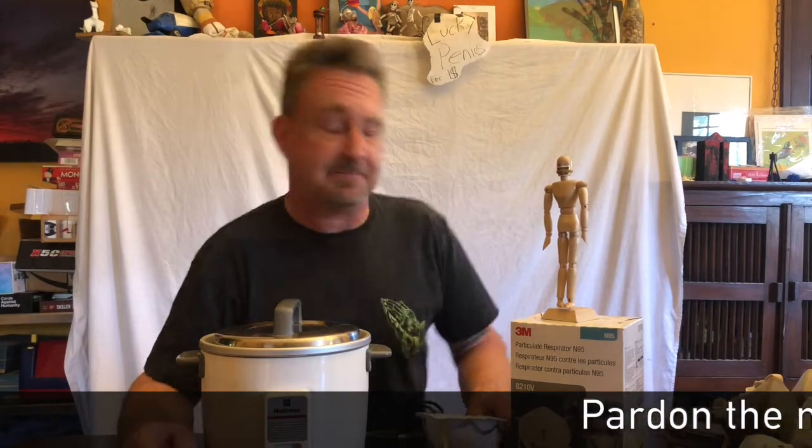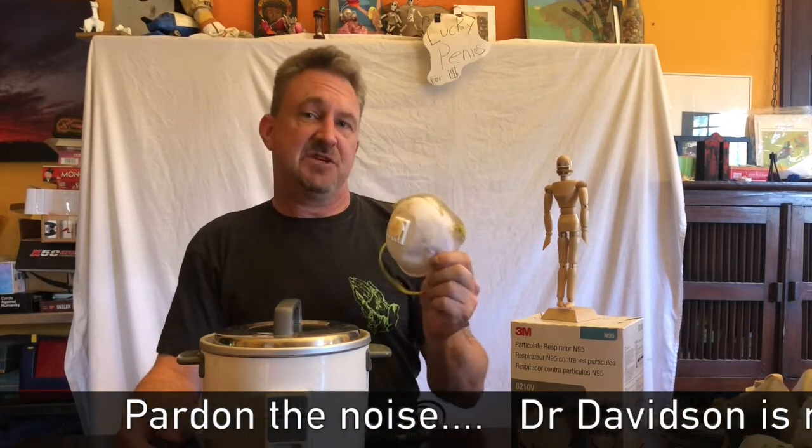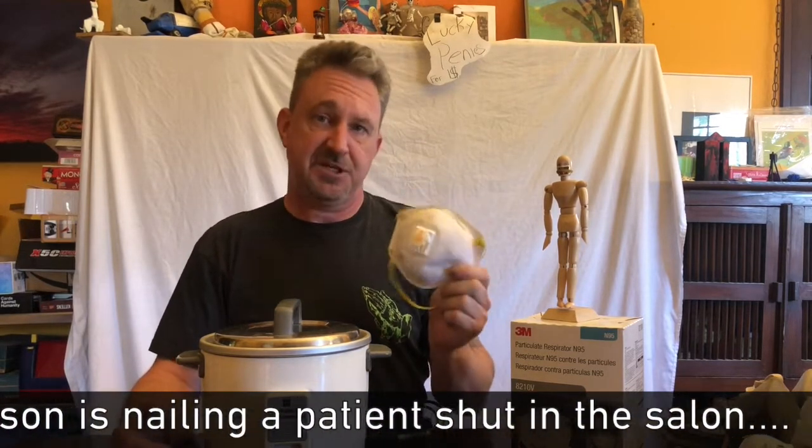Hello and welcome to Amateur Web MDTV. I'm Tad and I'll be your amateur surgeon for today. This is an N95 mask. This piece of equipment has been in very short supply and I want to talk to you today about how to sterilize it for reuse.